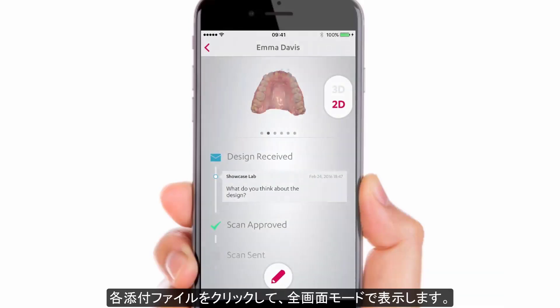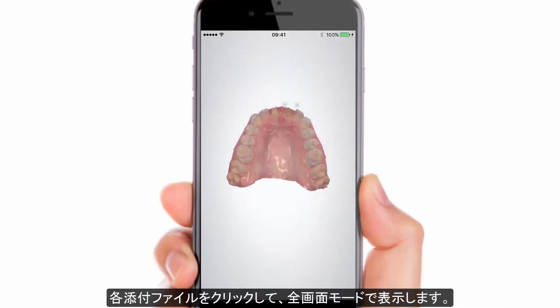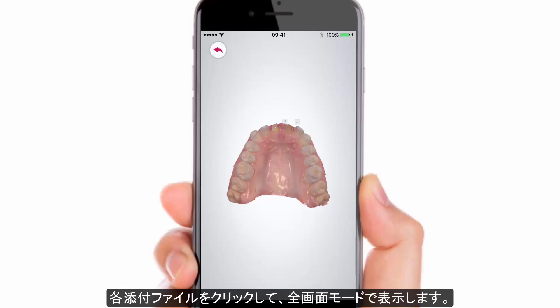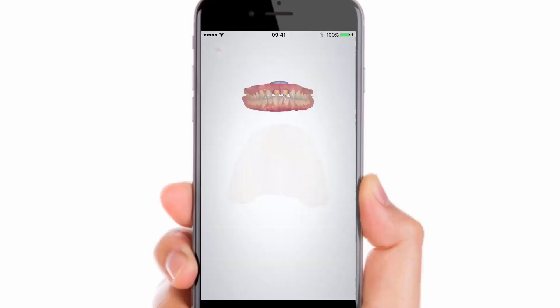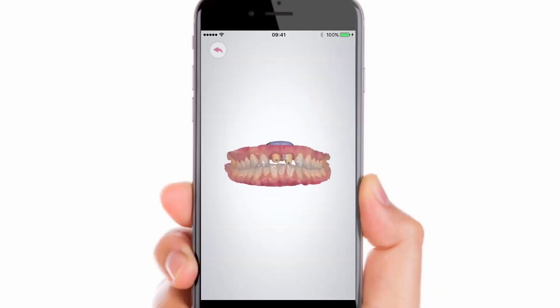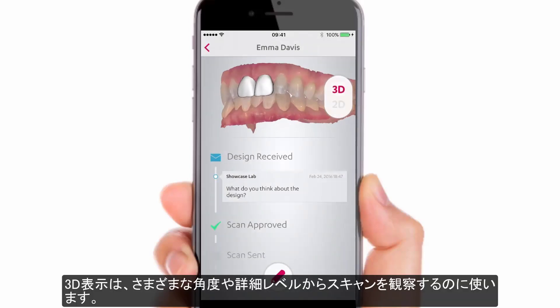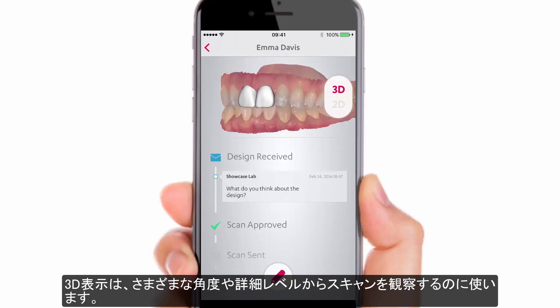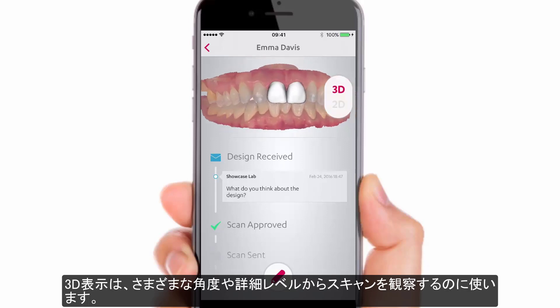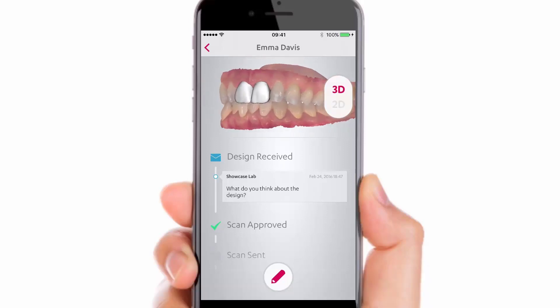Click on each attachment to see it in full screen mode. Use the 3D view to observe scans from different angles and different detail levels.